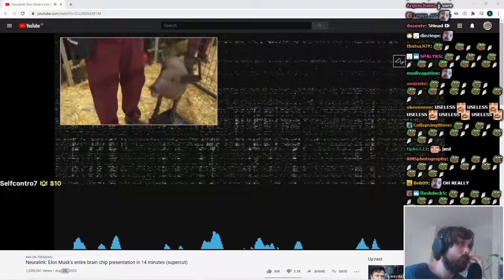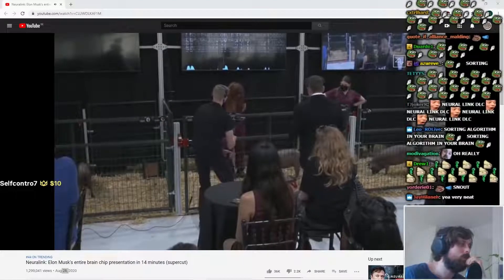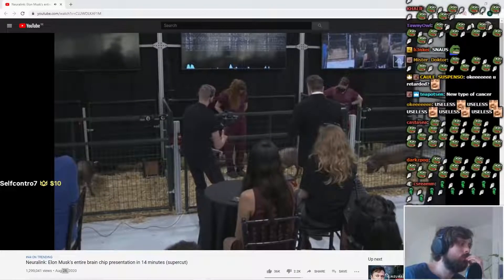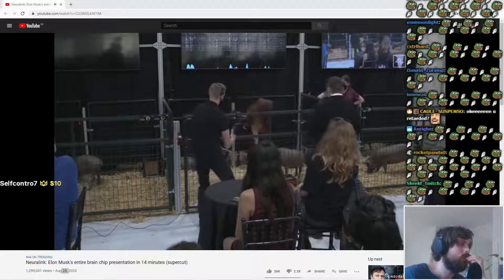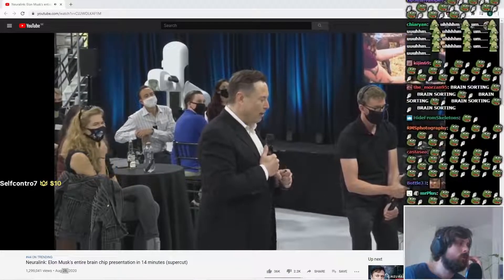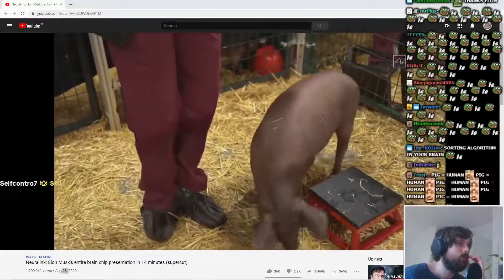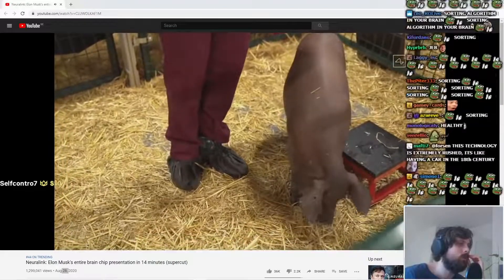That's what's making the beeping sound. As you can see, we have a healthy and happy pig — initially shy, but obviously high energy, kind of loving life. She's had the implant for two months. So this is a healthy and happy pig with an implant that is two months old and working well.